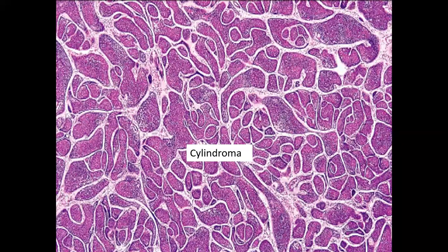Cylindroma. Cylindroma is a tumor originating from eccrine epithelium. The nests are so compact that they give a jigsaw puzzle appearance, and there are two kinds of cells in cylindromas. The peripheral cells will be darkly staining, while the cells which are present in the center of the nest are more eosinophilic.